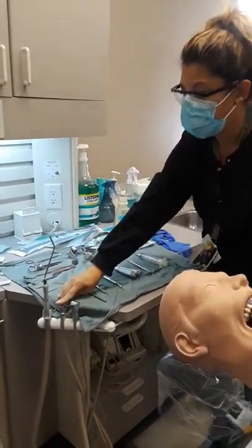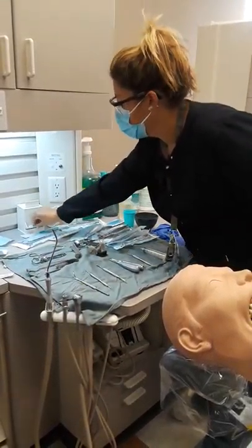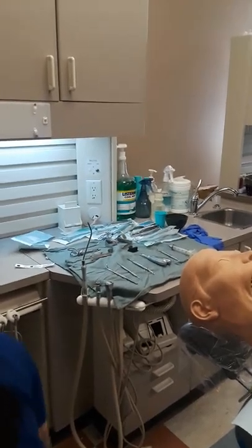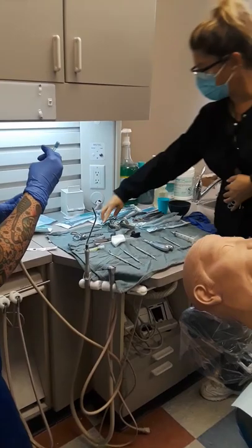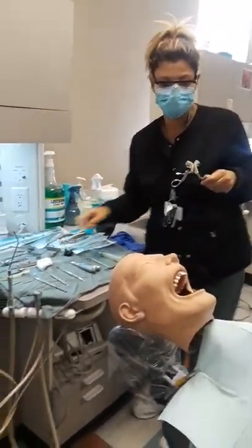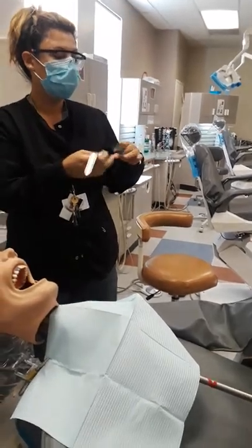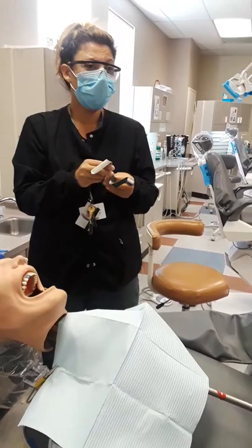Would you get the saliva ejector for me? Get a needle and the anesthetic. Topical gel. So I either have the mouth prop or bite block — I'll introduce you to those in a second. We have two different mouth retractors, and we're going to use these two that are referred to as Minnesota.